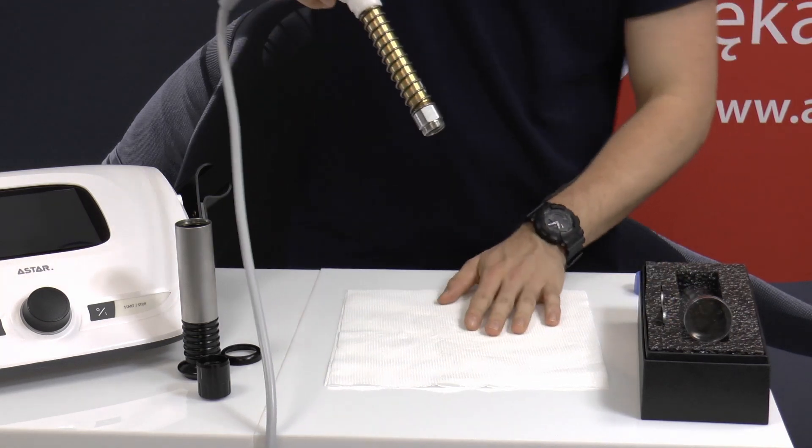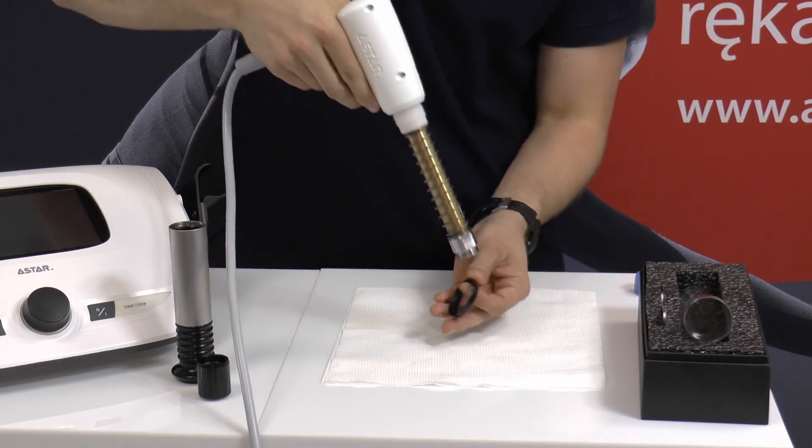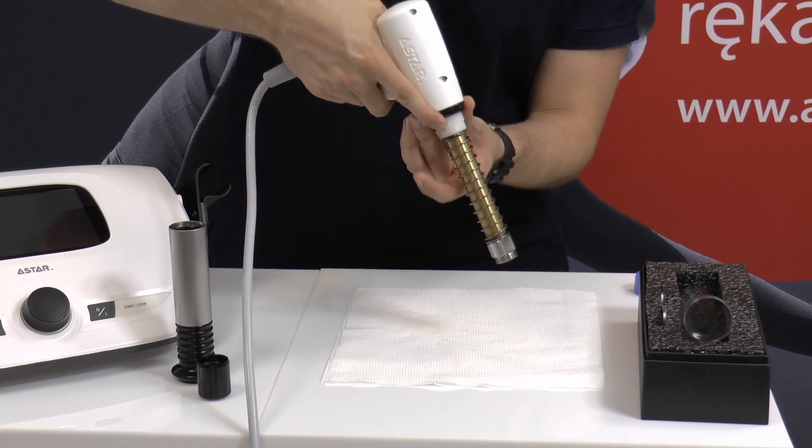Mount the tube, remembering to put the clamping ring, and tighten the transmitter until it stops.